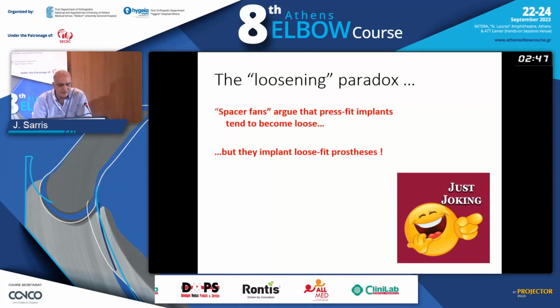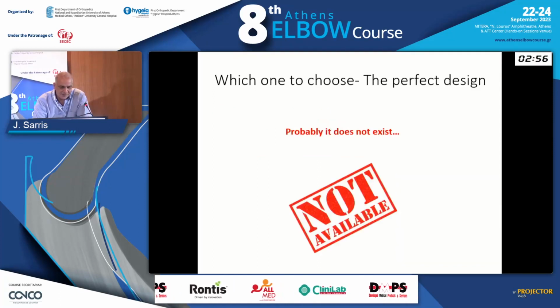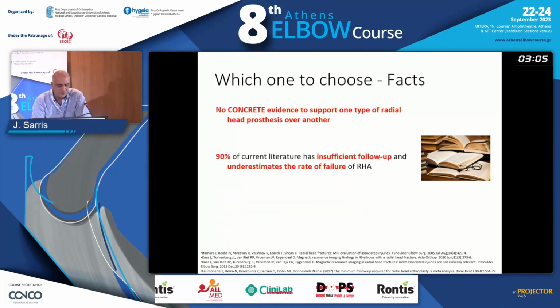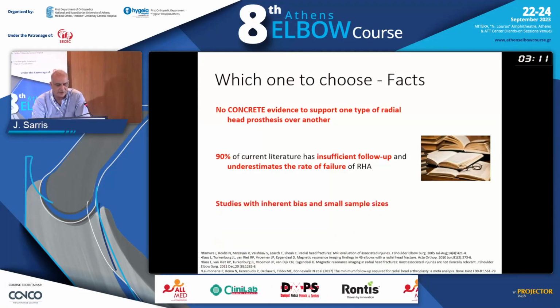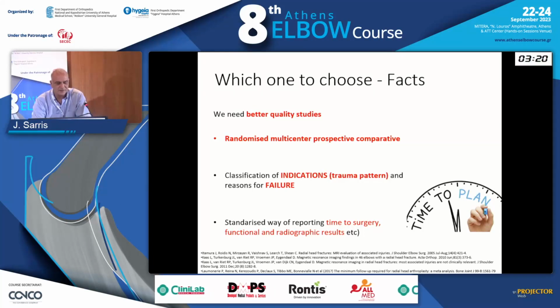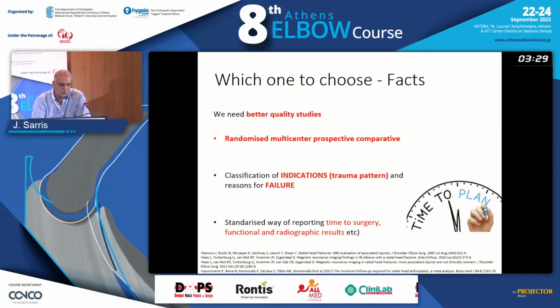And spacer fans argue that press fit implants tend to become loose, but the loose fit prosthesis... And that's a logical joke. So, probably it does not exist. Yes, it does not exist yet: no concrete evidence to support one type of radial head prosthesis over another. 90% of the current literature has insufficient follow-up, which underestimates the rate of failure, and the studies have inherent bias and small sample sizes. We need better studies, with indications written carefully, the trauma pattern, the reasons of failure, and other factors that will contribute to a better study.